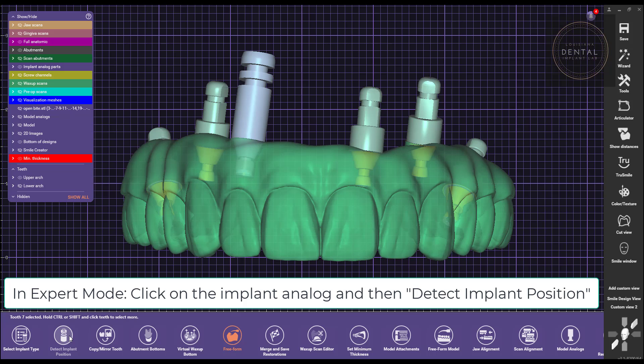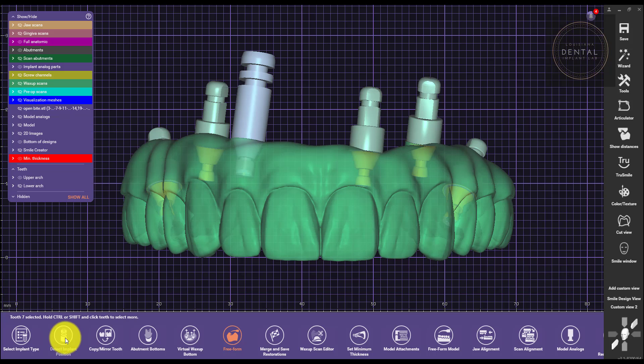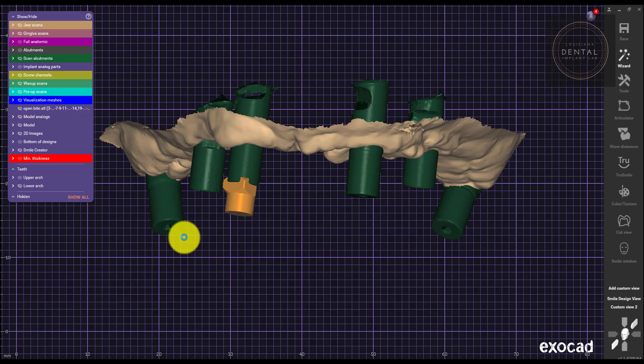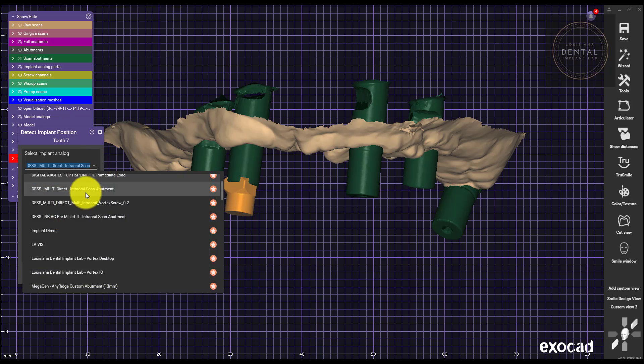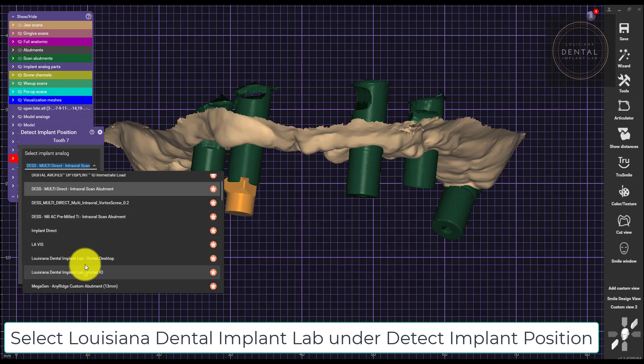make sure that you click on the implant analog you would like to change to detect the new implant screw seat. In this case, we're going to select Louisiana Dental Implant Lab under detect implant position.